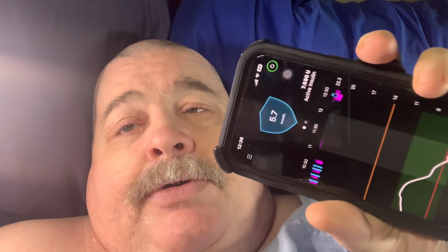so that you can go and grab the pump and just say, hey, my blood sugar's at 5.7. You can take a look at your Apple Watch and say, oh, my blood sugar is 5.7. You can use the app on your phone to say, oh, my blood sugar is 5.7. You know what? It's amazing.